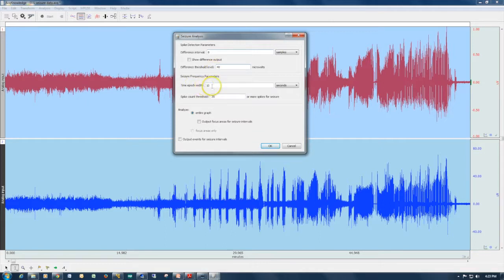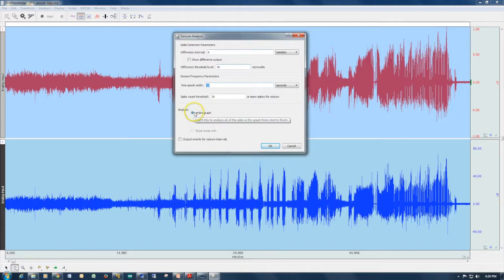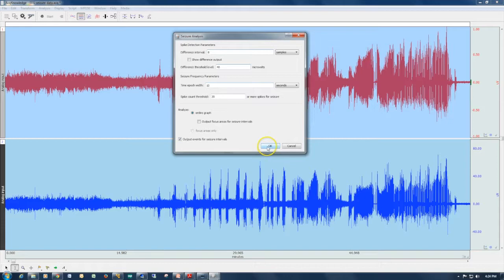We then have the option for setting the time epoch width, which can be set to any time period. I'm going to leave it set to 10 seconds. I can increase or decrease the number of spikes required within a 10-second time epoch before the epoch is classified as containing a seizure. There are also options for analyzing the entire graph and outputting focus areas for seizure intervals, as well as outputting events for seizure intervals. I'll hit OK to run the analysis.